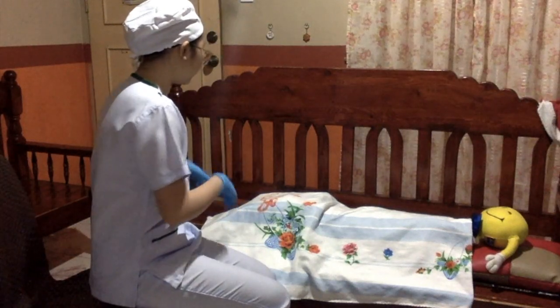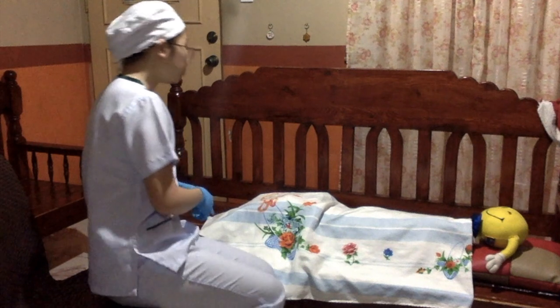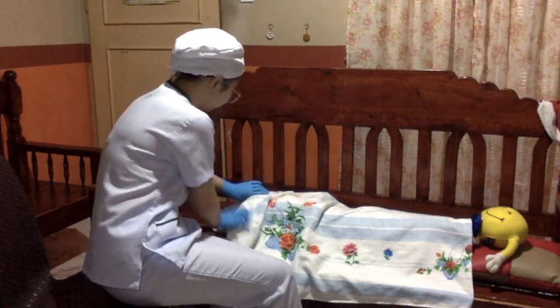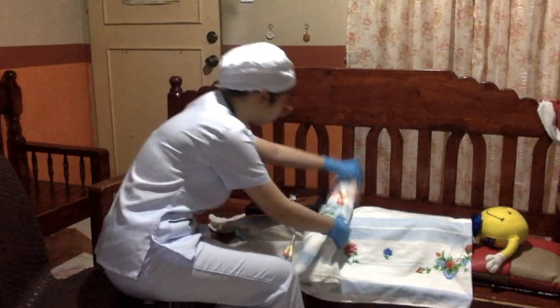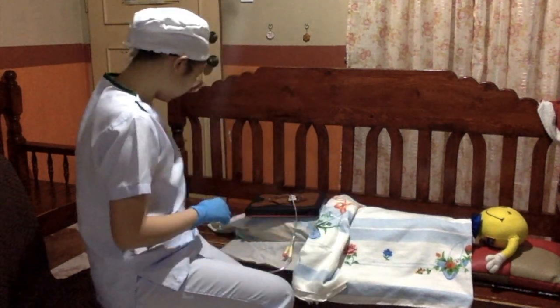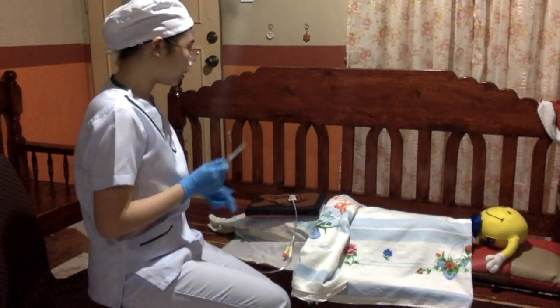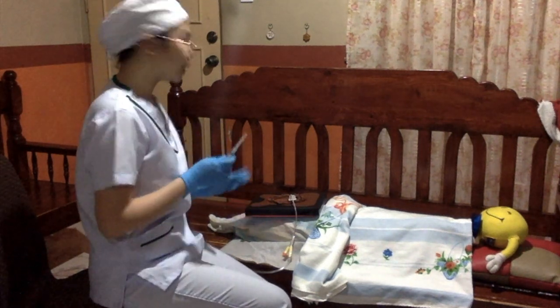Obtain urine specimen if ordered. So this permits the removal of sterile specimens before loss of access. Ms. Smiley, bali, taas ko na po ng kaunti yung kumot nyo ha. Magsisimula na po ako. I will now insert the syringe into the balloon port to aspirate the 10 ml of fluid that is used to inflate the balloon.